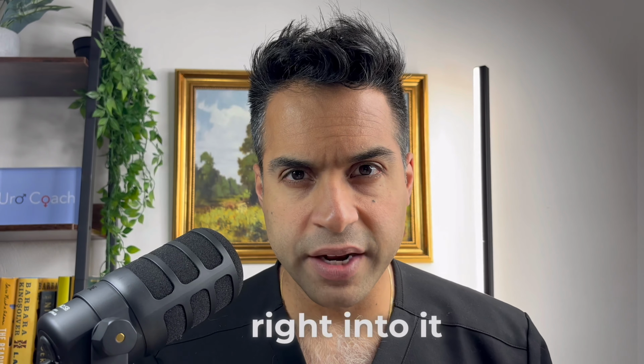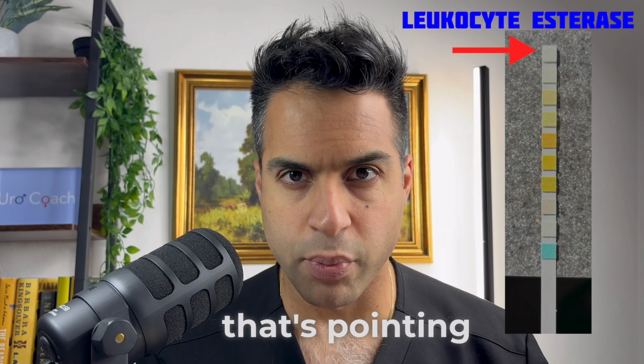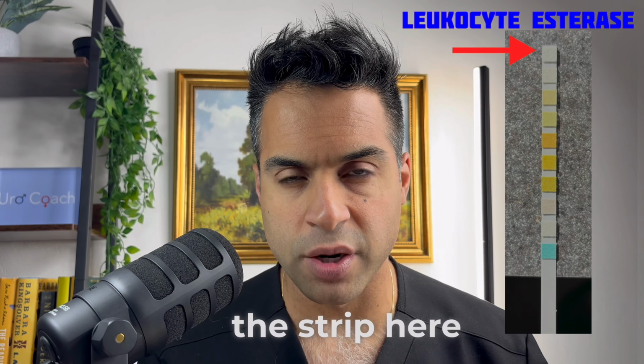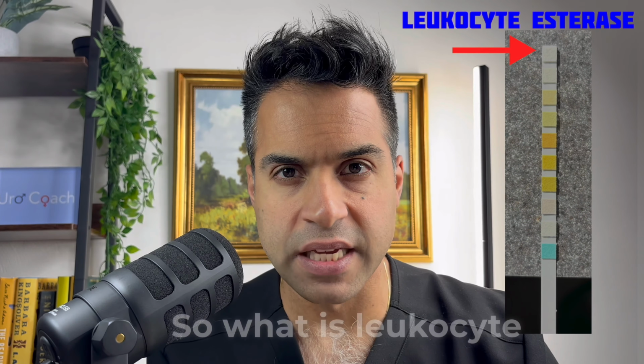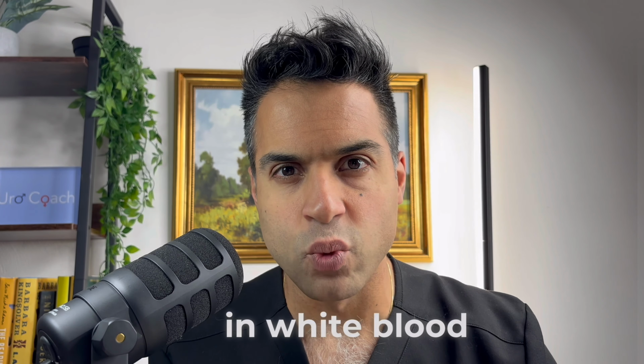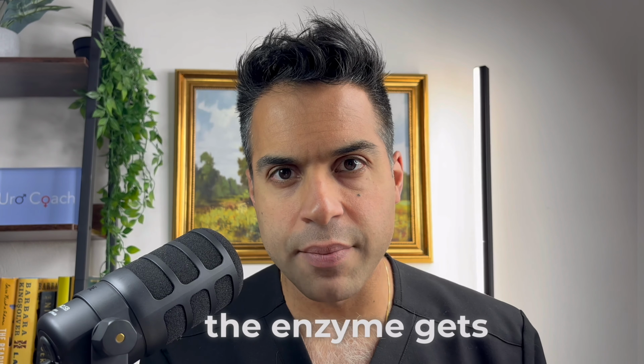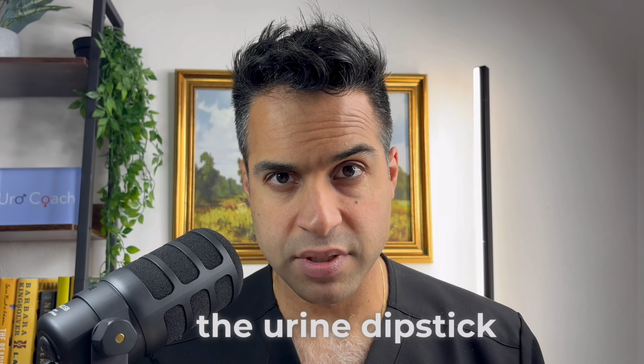All right, guys, so let's get right into it. So first of all, leukocyte esterase. If you look at this diagram, it's the arrow that's pointing towards this part of the strip here, okay? So what is leukocyte esterase? Leukocyte esterase is an enzyme that is carried in white blood cells, all right? When these white blood cells break down, the enzyme gets secreted, and that's what the urine dipstick picks up.